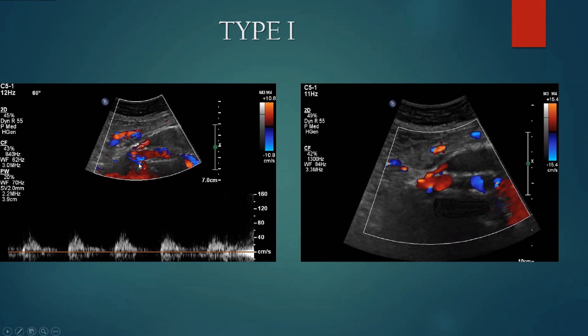So here's a spectral Doppler and then our color Doppler. And again, our color scale is at low, like at 15, our PRF. We have our dynamic range at 55, which is good. You can see the outer wall here and the attachment of the stent graft. So just doing these optimization cues will help you achieve a good image.